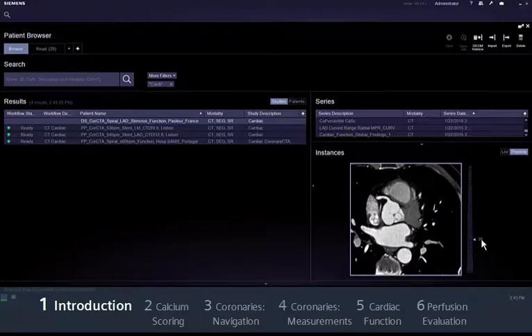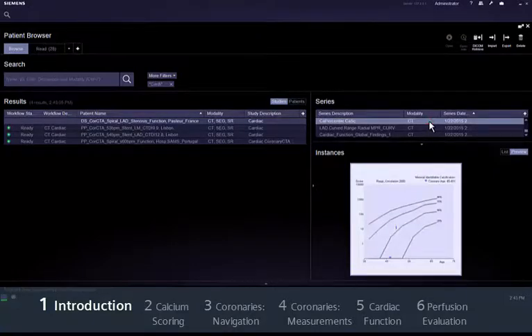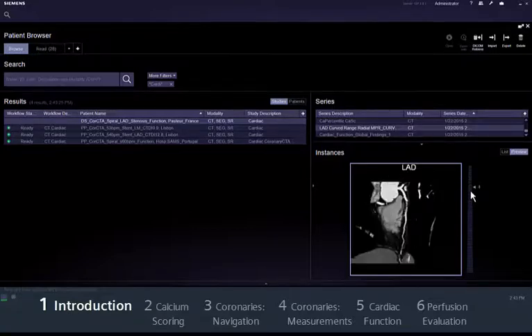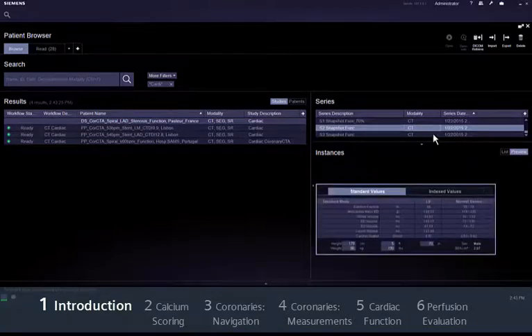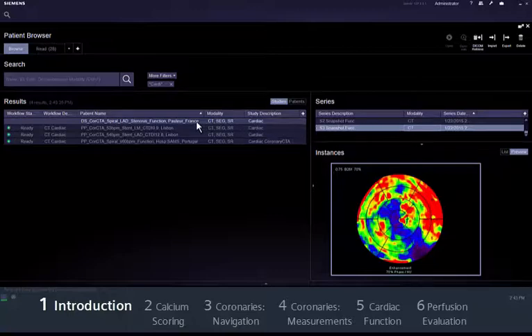Zyngivia provides you with smart tools for reading your cardiac cases, whether it involves risk stratification with calcium scoring, ruling out coronary heart disease, stenosis evaluation, stent planning, functional analysis or a complete assessment of myocardial function based on its enhancement or on quantitative dynamic CT myocardial perfusion. This movie will show you how to evaluate CT cardiac data sets using Zyngivia.